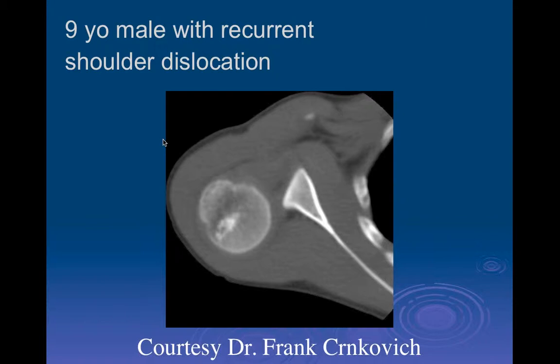And then just like we see with Bankart lesion, notice that when this occurs, there's a lot of force trying to pull the humeral head back in position again, and the labrum can get sheared off here, as we're seeing in this particular case. Here's the labrum sheared off from the posterior glenoid. And then this is just the coronal and another axial image of that.